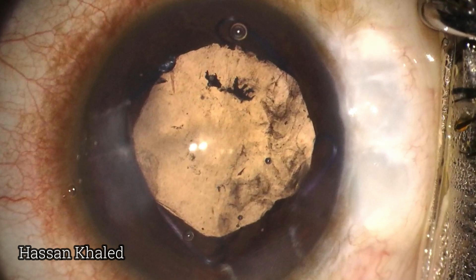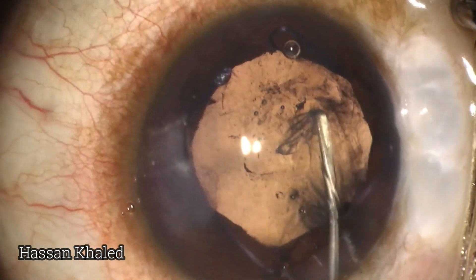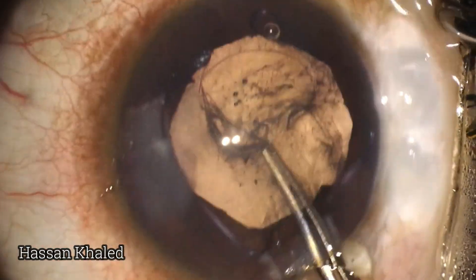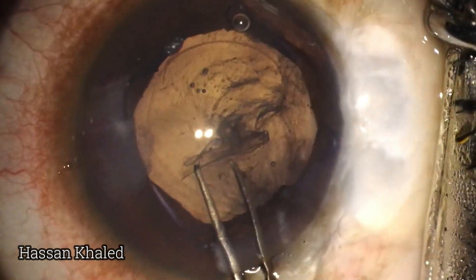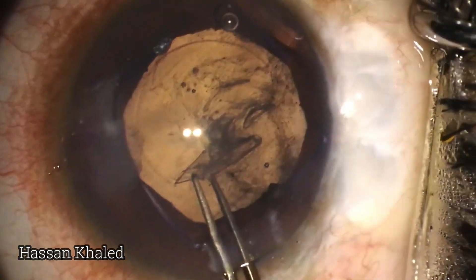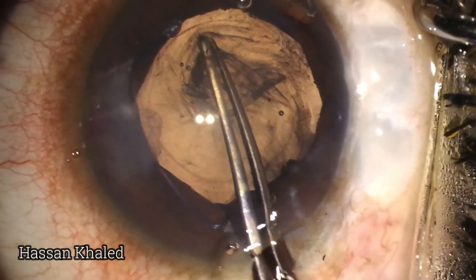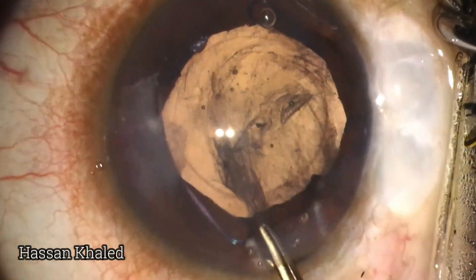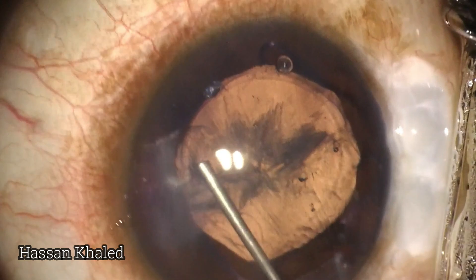Now look at the pupil diameter — it is very good to start the capsulorhexis. I used the cystotome to create a tear in the anterior capsule, then completed the capsulorhexis using the capsulorhexis forceps. As you can see, I now have a good diameter capsulorhexis.